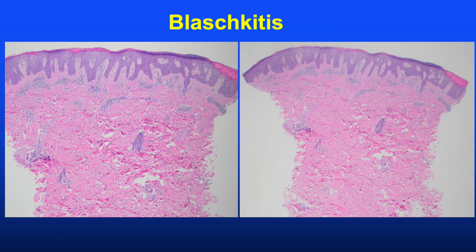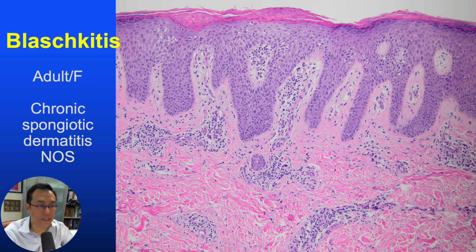In this one example of clinically confirmed Blaschkitis, one sees epidermal hyperplasia with somewhat irregular elongation of rete ridges, or irregular epidermal hyperplasia, or irregular psoriasiform hyperplasia, whatever term you like to use. There is also parakeratosis with crust, in the context of admixed acute, subacute, and chronic changes.